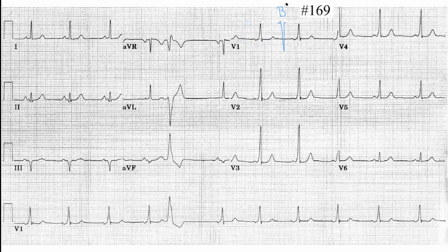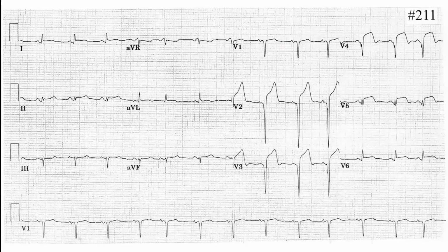What was the syndrome? WPW, Wolff-Parkinson-White syndrome, the pre-excitation syndrome. Watch the theory. All right, good. Let's see who is the next one.